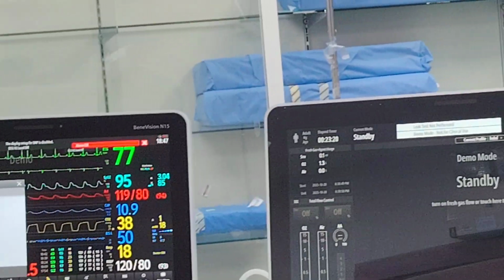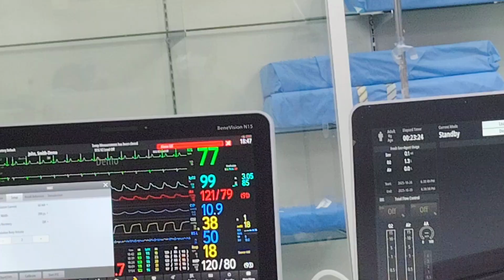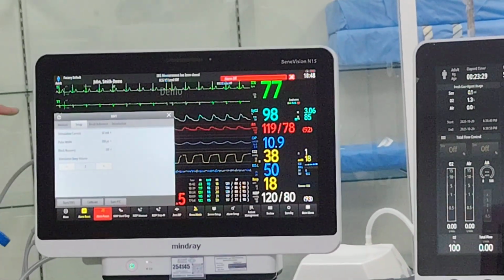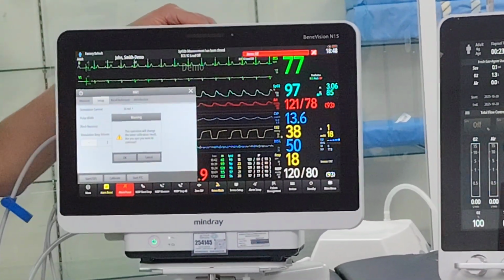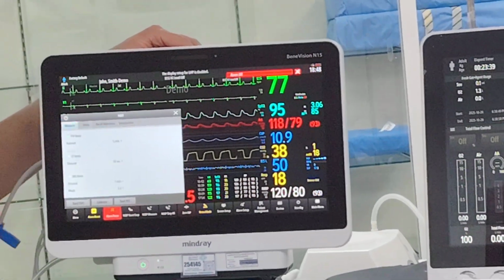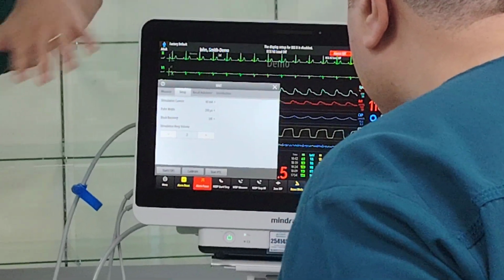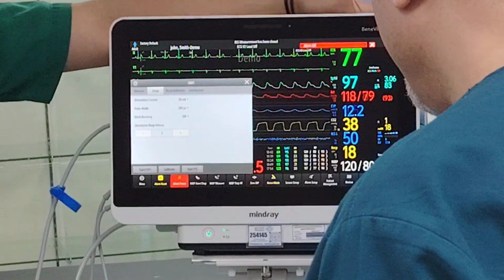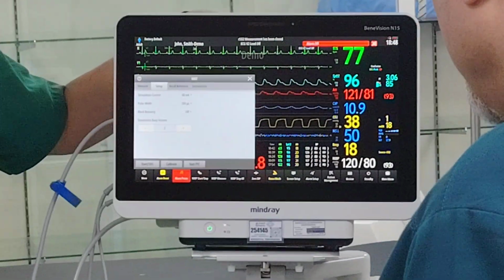Now, the standard for adult is 60, but for pediatric, which I will save for later, just so you know, sometimes you have to make it lower. 60 is too much. You will click here and usually 30 is enough. You see, it will change the results. So remember, measure, set up, check the voltage. Adult 60 is fine, pediatric is 30. I will make it a default setting for you, but as experts you definitely have to double check. Maybe I made a mistake, maybe someone played around with it, you never know.